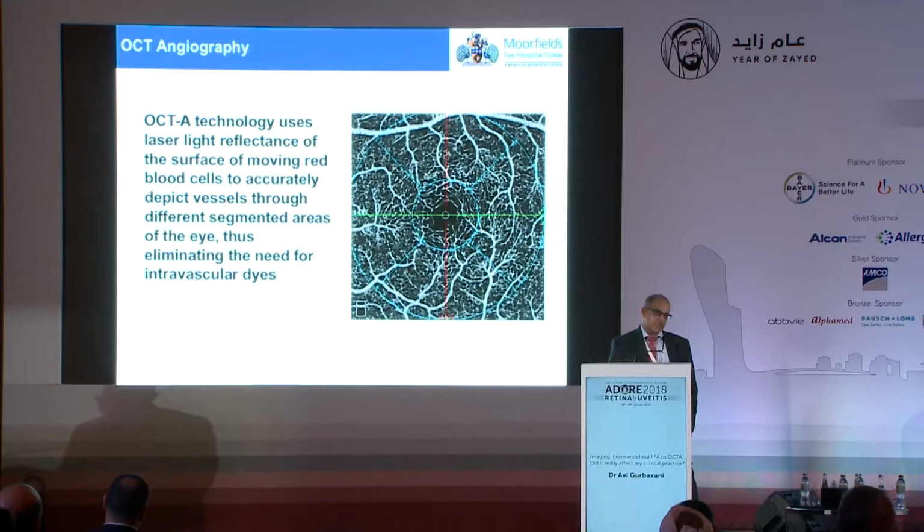OCT angiography. I have to confess that we don't have an OCT angiography machine in our clinic full-time, so we've had a few on loan. But it uses the laser light reflectance of the blood vessels, so it depends on the flow of the blood vessels to delineate these blood vessels.